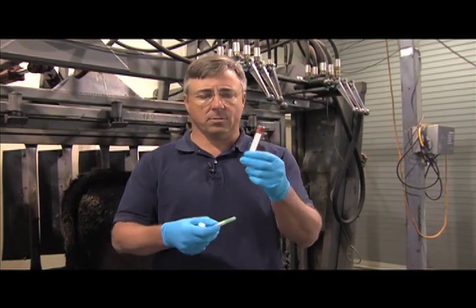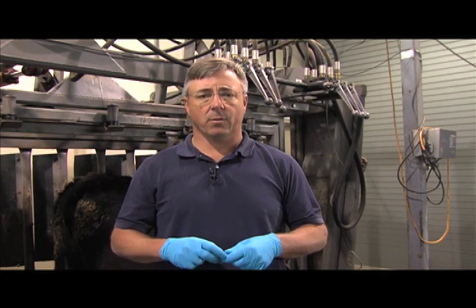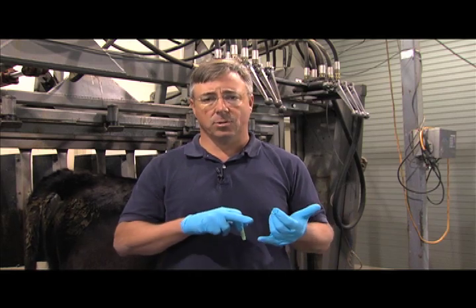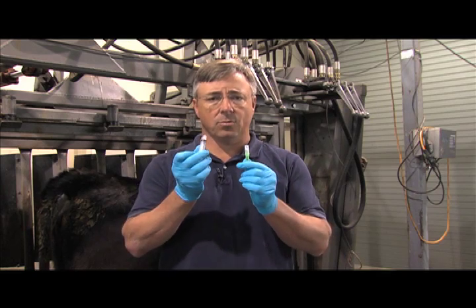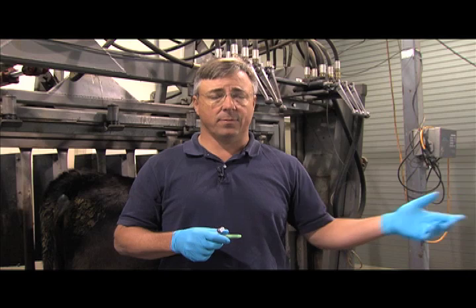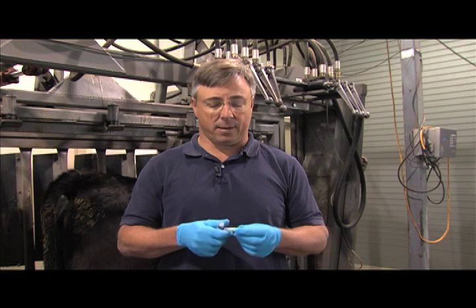Typically, you will get your sampling tubes and your paperwork from the company that's going to analyze your blood samples. For instance, in Bowling Green, Kentucky, Gold Standard Labs analyzes blood samples for pregnancy for beef cattle producers. If you call that company, they will send you the paperwork, they will send you the blood tubes, and if you need, they will send you the needles and syringes to take the samples. Typically, within a week of sending your blood samples, you will get that analysis back, and again, it's about 95% accurate.